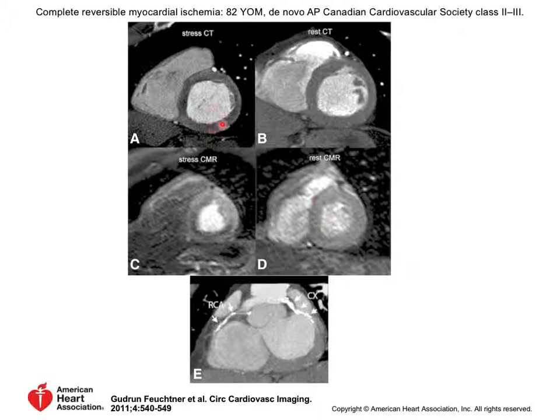But you can see in CT, even though the image quality is quite high, the resolution is much better than MR. You trust the edges better, and there's all these fine structures you can see. The actual change in Hounsfield unit, like during the injection in the myocardium, is very subtle, right? So this person's positive on MR. Everybody's going to call this positive, and you're going to be right with this guy. Here you can see that's a pretty subtle thing on CT, right?